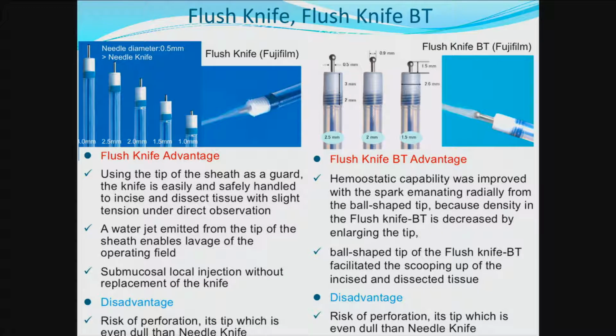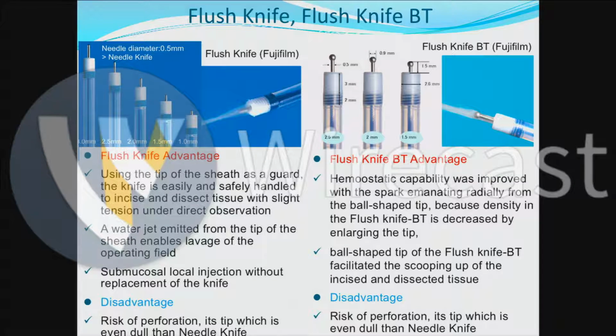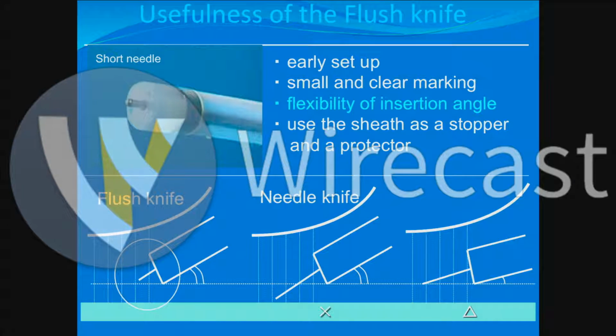However, a disadvantage is that there is still some risk of perforation. This is even duller than a needle knife, which is the usefulness of the Flush knife.